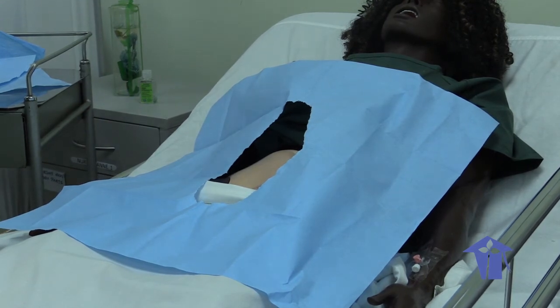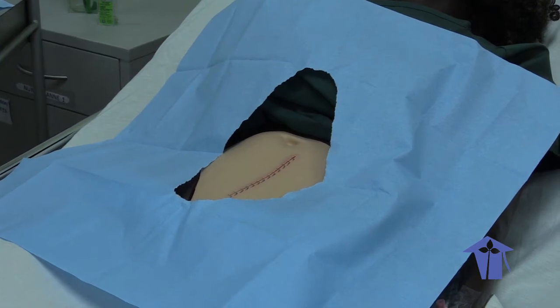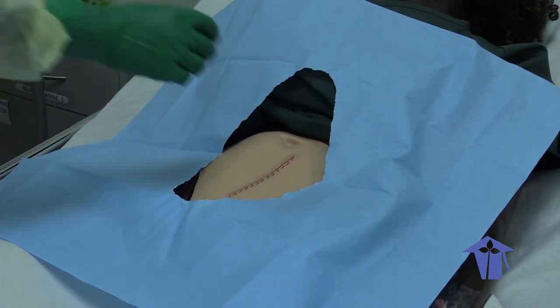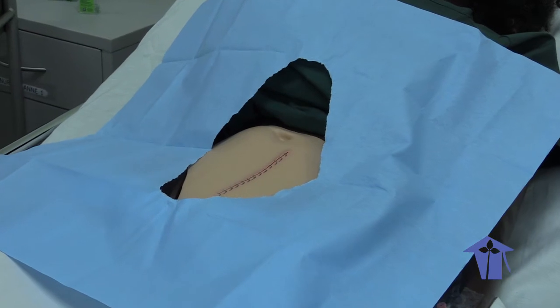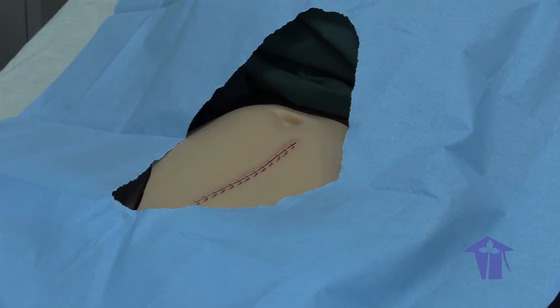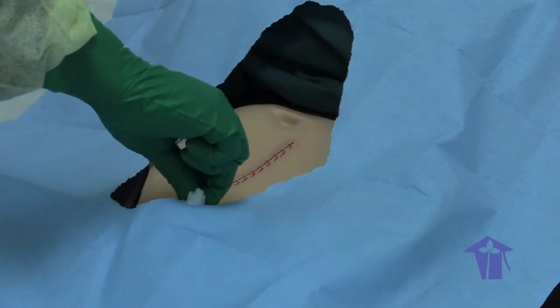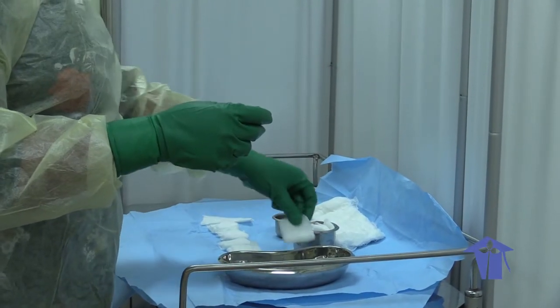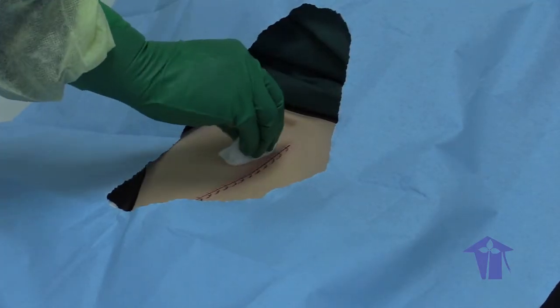You can now start to clean the patient's wound. Using your gauze squares with required cleaning solution, clean the center of the wound first. One wipe and discard. Clean the point furthest away from you. One wipe and discard. Ensure to maintain the forceps method when passing gauze squares to hand.